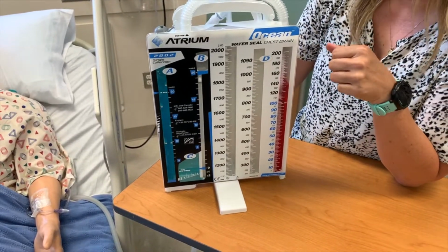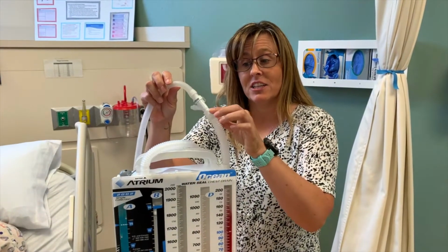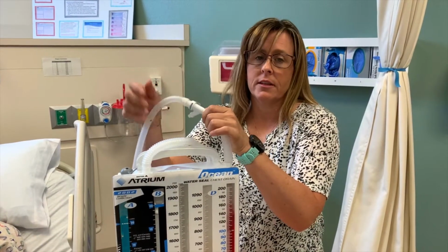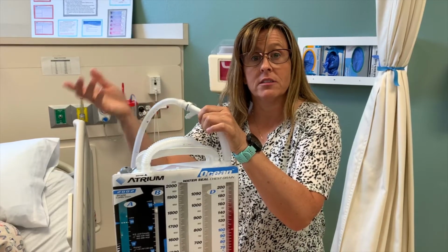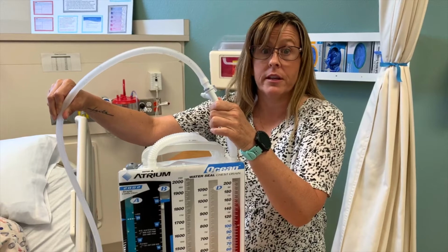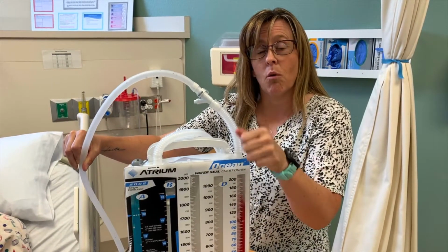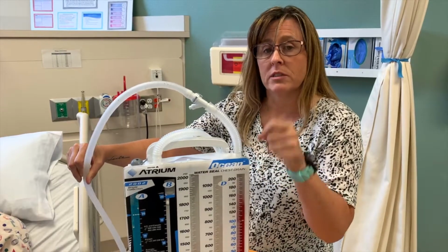So remember what I talked about today. Oh, well, what if it comes apart from the patient? Get that into sterile water. Instead of reconnecting it, you can also put it in that sterile water until you can get a brand new tubing, because if that did fall on the floor, you need to get a brand new tubing set. Get that in the sterile water so that you can get that water seal resumed once again.